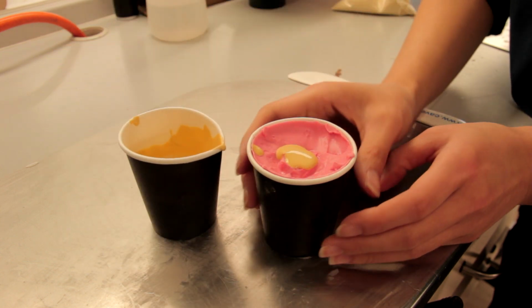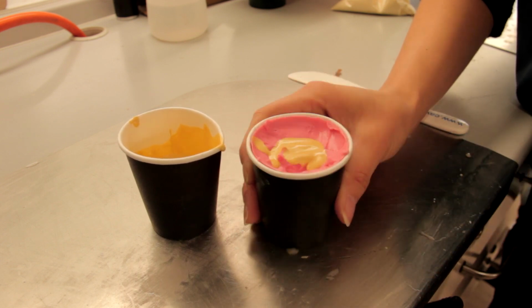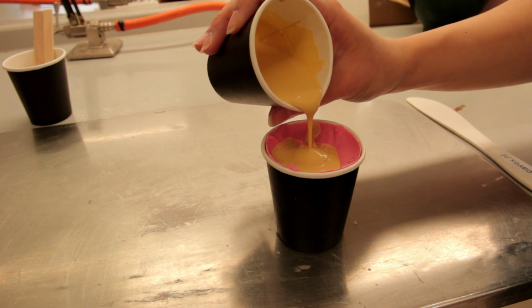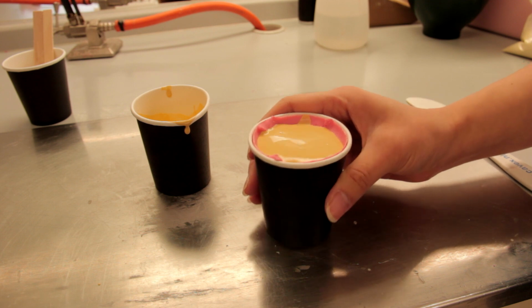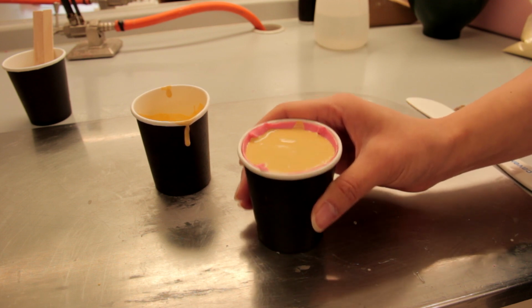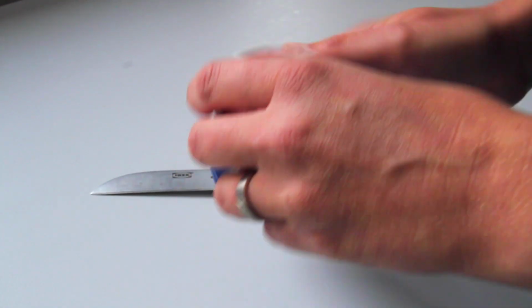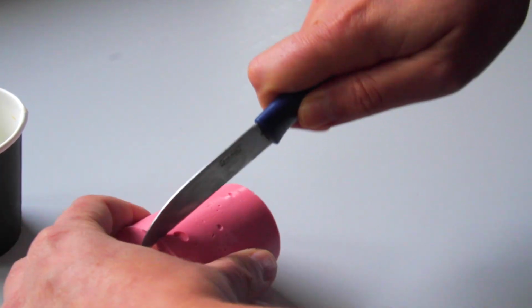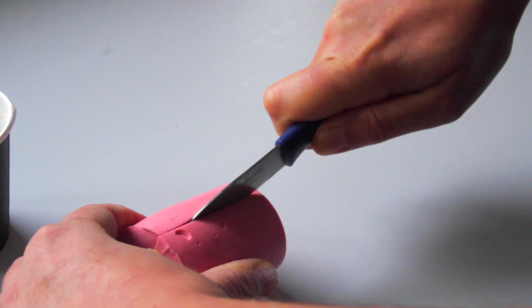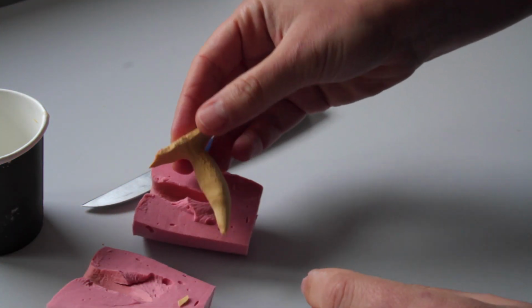When it fills to the top, shake it carefully to make sure there's no bubbles in it, and then add the rest of the plaster. Give it a last shake and leave for at least 3 hours until it's dry. When it looks firm, take the model out of the cup and carefully cut down the middle on both sides. Then open it and you will see the impression of the fur seal's tooth.